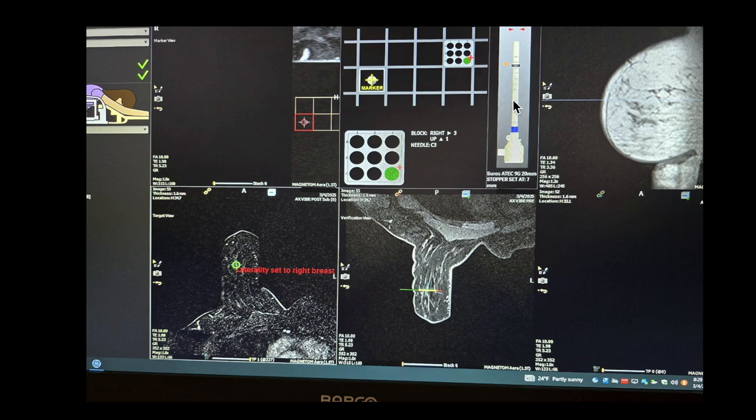This will tell you the depth. This is a circular ring that can be placed on this measuring device, and this says 7 millimeters, so this is 7 millimeters in, so that you know where to put everything to get to your target, and this is a symbol of what you would be doing during your biopsy.